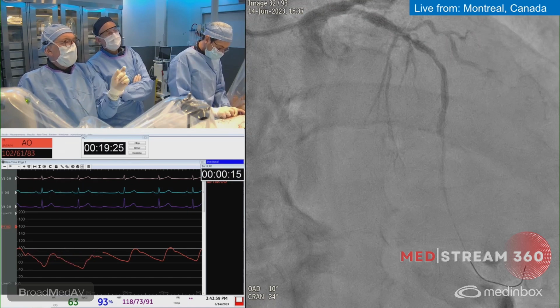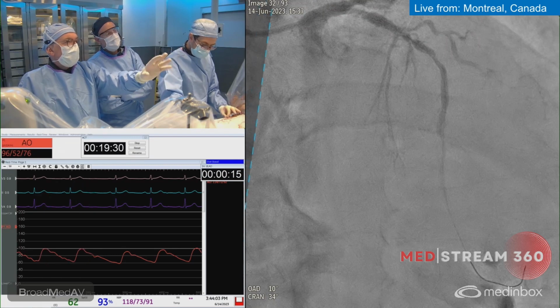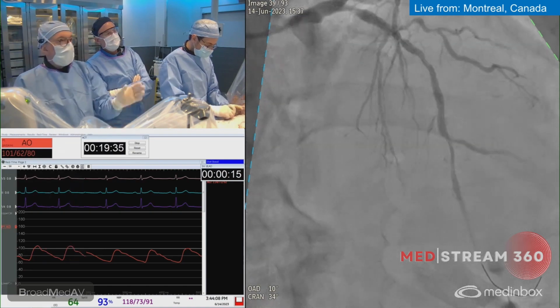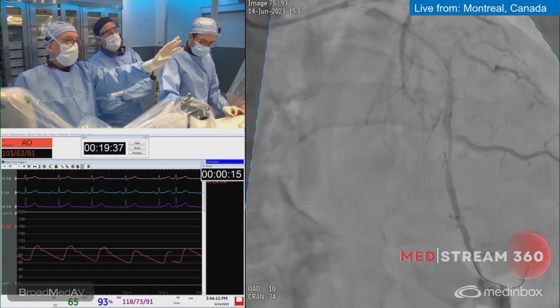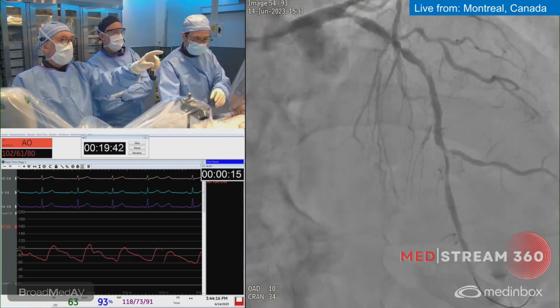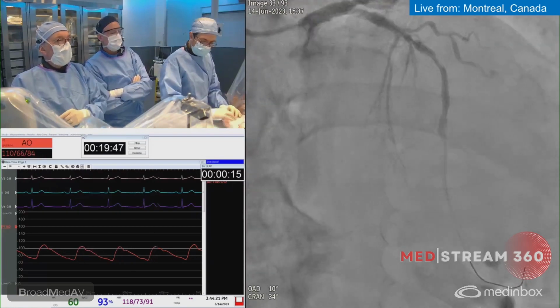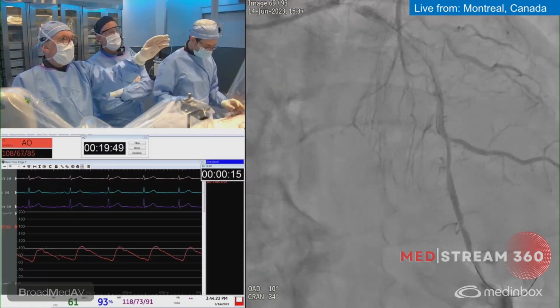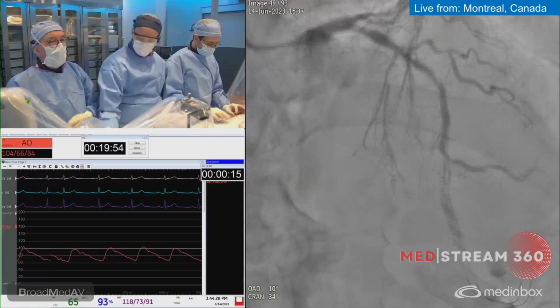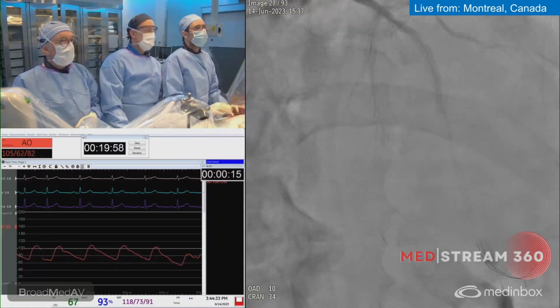I agree completely, and depending on how short the balloon we have, and then distal, you see if it's guiding is 6 French 2 millimeter. Can do the IVUS, but it looks like 2.5 maybe, maybe 2.75. I think 2.75. Okay, 2.75, fair enough. And for the length, at least let's say 23, just to make sure. Yeah, that was going to be my suggestion, to make sure we cover the distal lesion and then go back to be able to do a POT. Okay, so let's take 2.75, 23 stent.